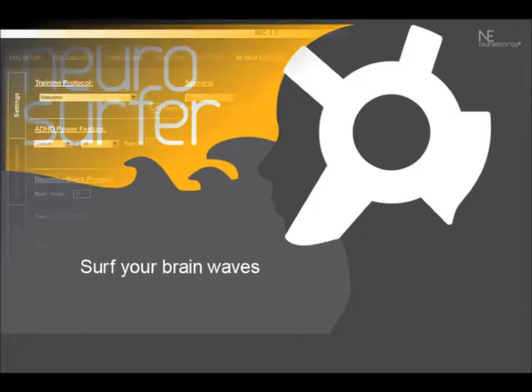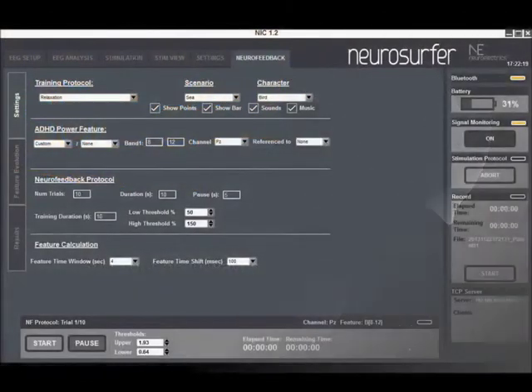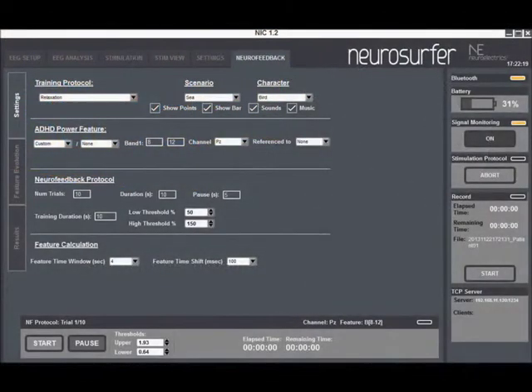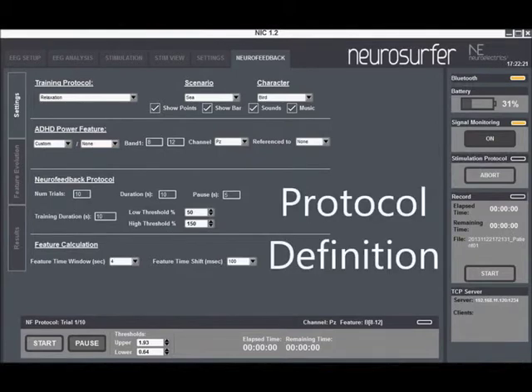With Neurosurfer you can select and configure different protocols based on EEG power features. The protocol definition includes definition of trials and their duration.